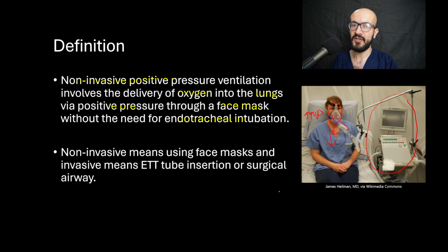It also leads to the alveoli staying open and not collapsing in cases such as chronic obstructive pulmonary disease and cardiogenic pulmonary edema. Non-invasive means using face masks, and invasive means endotracheal tube insertion or surgical airway.